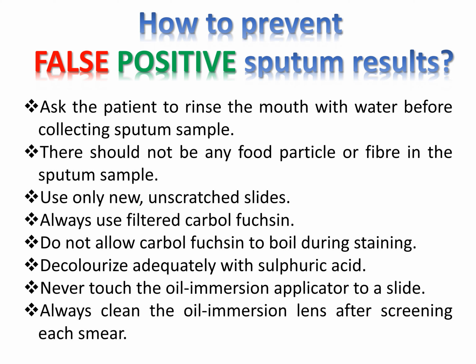the possibility of drug resistance must be considered. How to prevent false positive sputum results? Ask the patients to rinse the mouth with water before collecting the sputum sample. There should not be any food particle or fiber in the sputum sample.